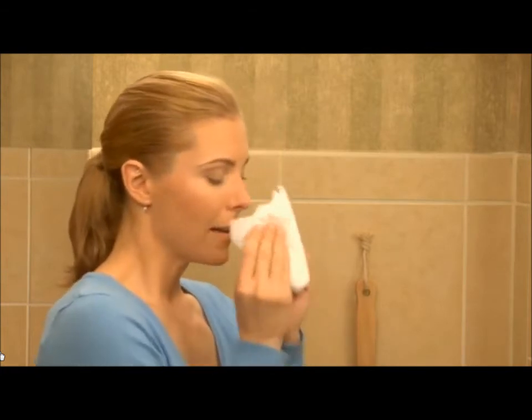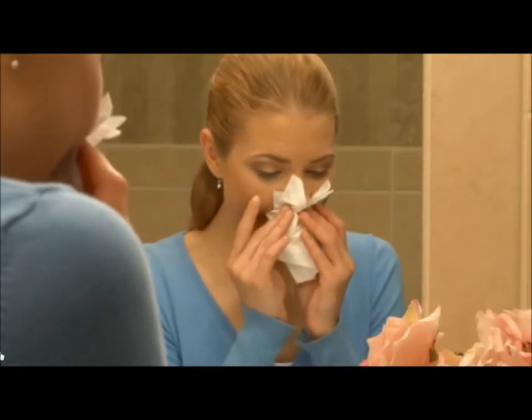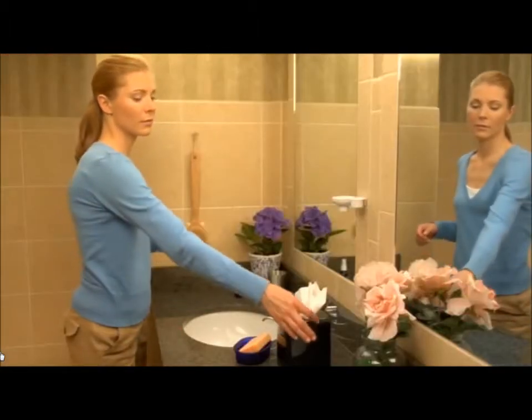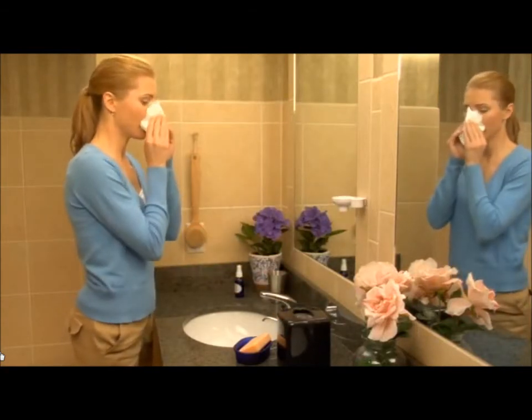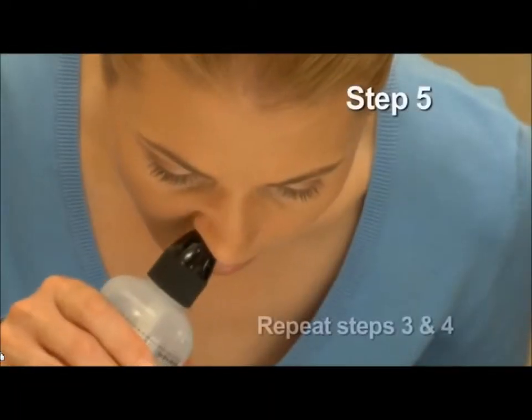Blow your nose gently without pinching your nose completely, because this will create pressure on the eardrums. Some solution will reach the back of the throat, so please spit it out. To help improve drainage of any remaining solution, blow your nose gently while tilting your head to the opposite side of the nasal passage that you just rinsed.